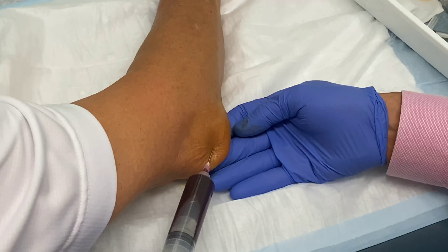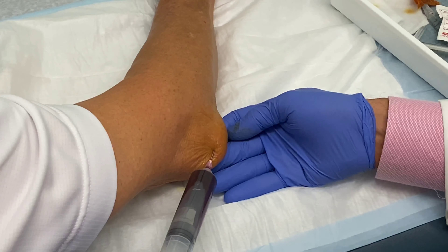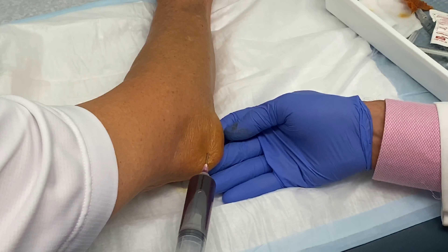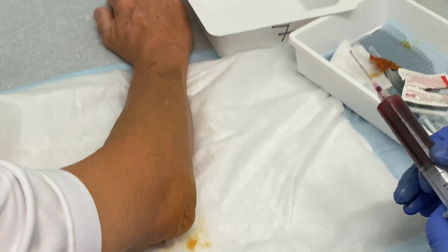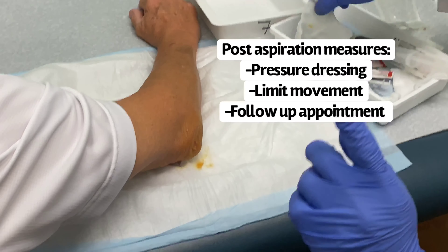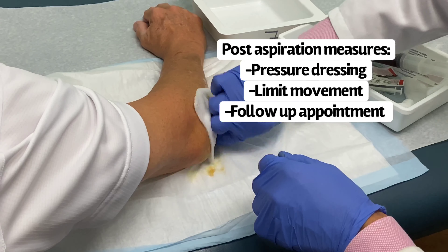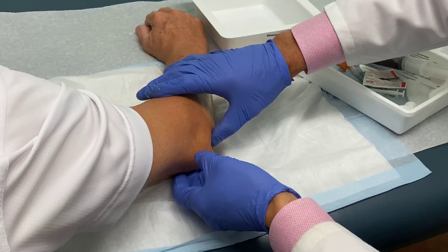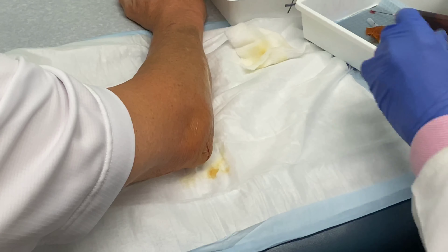There we go — bloody traumatic olecranon bursitis. I'll put a little pressure dressing on it. The important points here: get an x-ray first — this particular case did have a tiny little bone chip. So get an x-ray, make sure everything's okay, and then aspirate if you need to. Thank you very much.